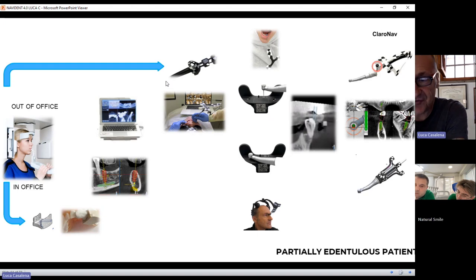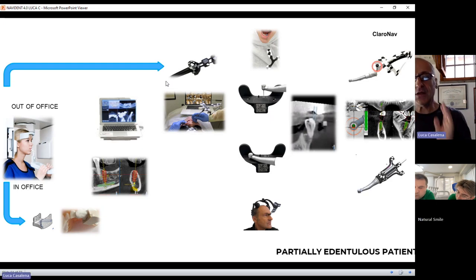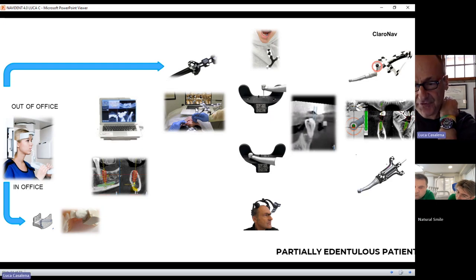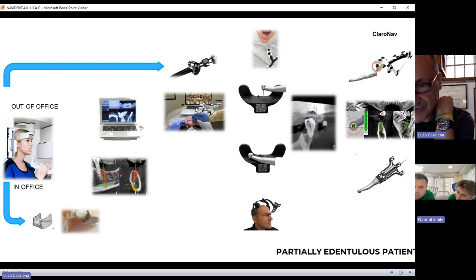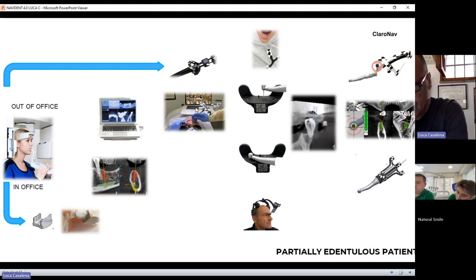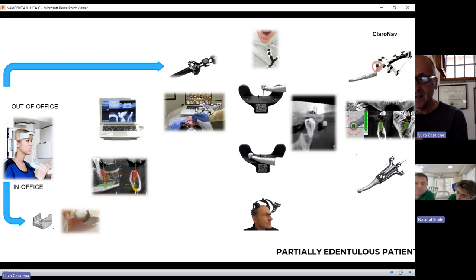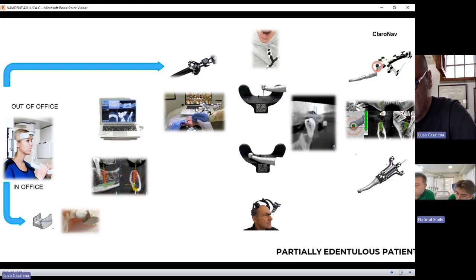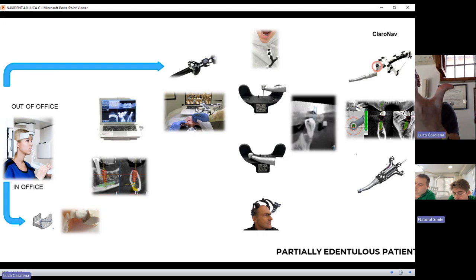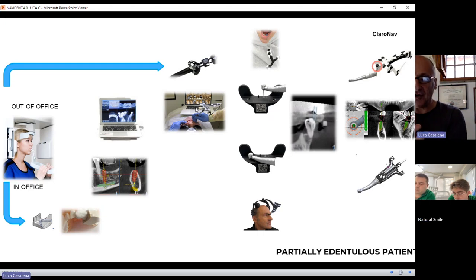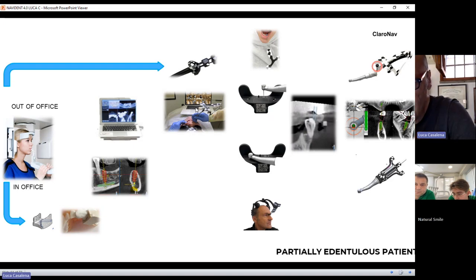You need to touch the trigger point and stay put for one second — you go after cusps. The choice of which cusps is yours, but it's given by the need for a tripod. You don't want three points aligned, because if you choose three aligned points the registration gets shaky. If you take three points on a tripod, the software can easily register those three points onto the 3D rendering of the patient.